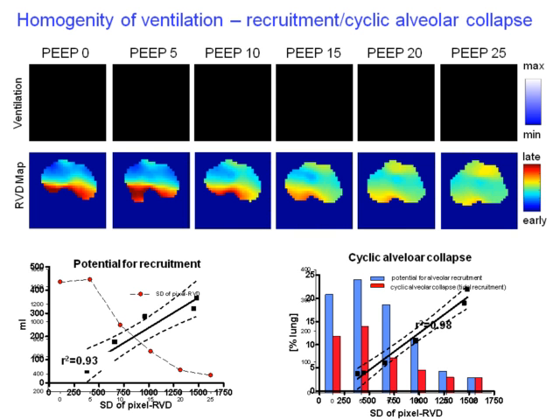And you see that with different PEEP positions you see differences in this delay, differences in the homogeneity of mechanical ventilation or ventilation distribution. I only show you that, and it's discussed then in detail, because I try to give you not only what we can do now, but what will be the future of such a system.